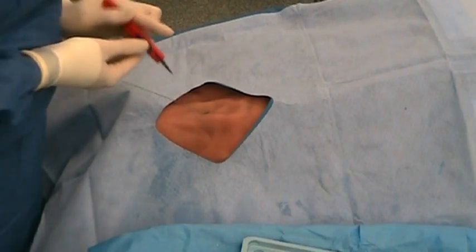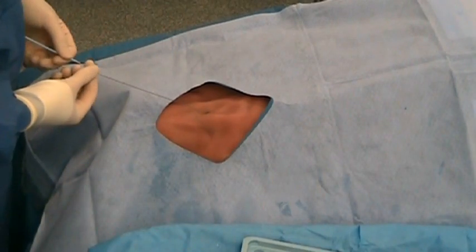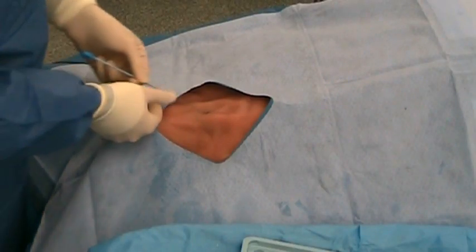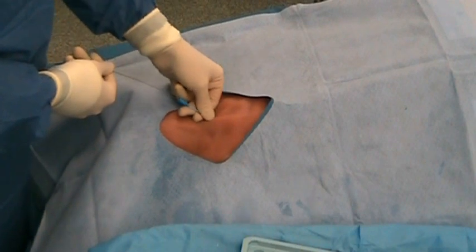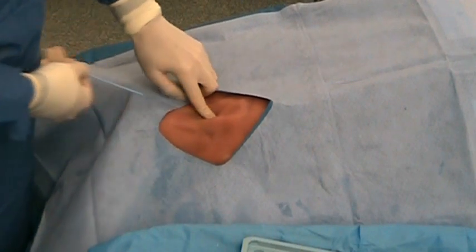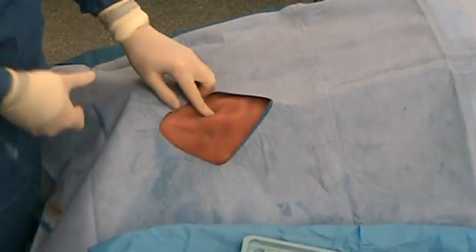The scalpel is used to make a nick incision into the skin. The dilator is placed over the guide wire through the skin into the vessel. The dilator is removed from the skin and a finger should be placed over the hole to limit bleeding.